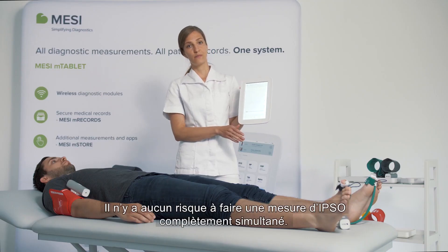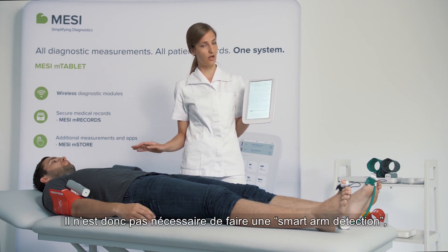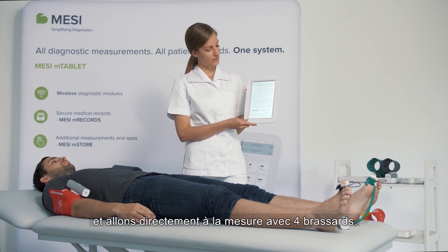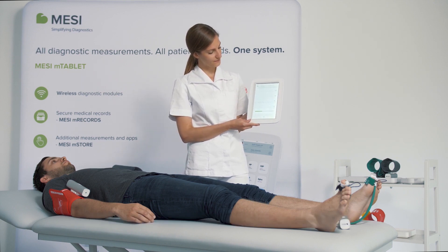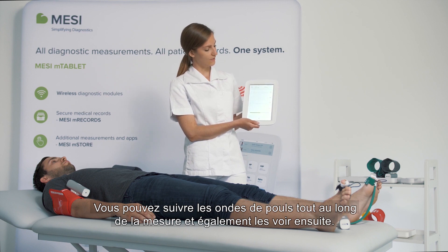It is safe to perform a TBI measurement completely simultaneously. In this case, we will not have the first part of the measurement with the smart arm detection, but it goes straight into a four-cuff measurement. You can monitor the pulse waveforms throughout the whole measurement and review them at the end.